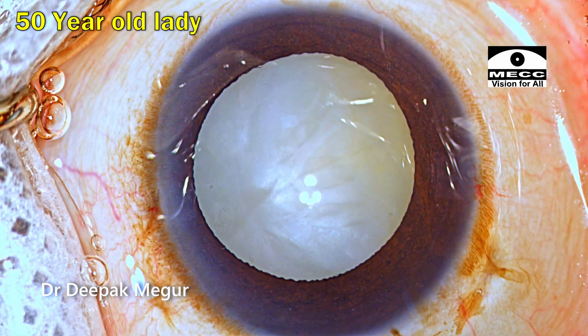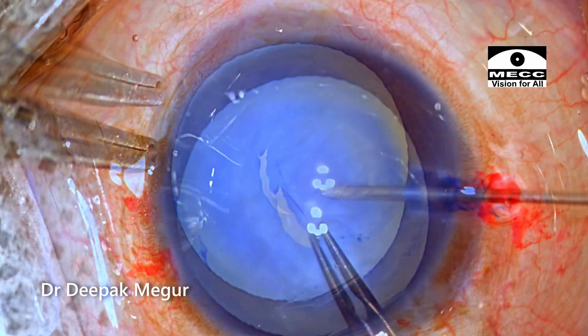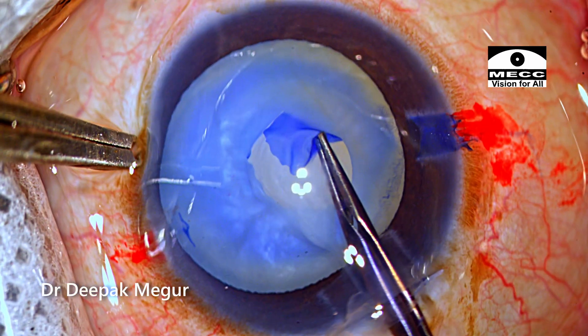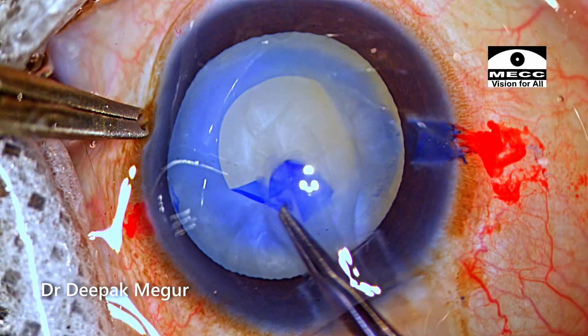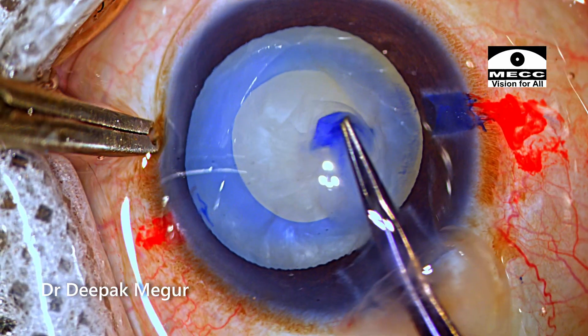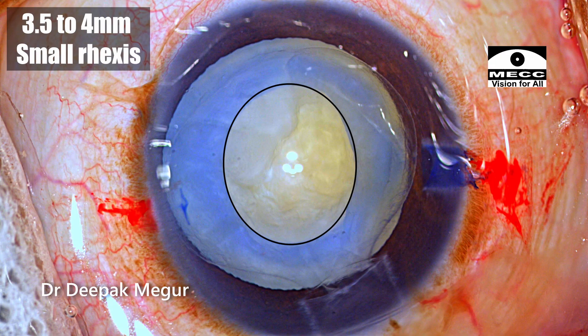This is an eye of a middle-aged patient who has an intumescent cataract. The plan is to do a two-stage rhexis. I am very careful to control the size of the rhexis, and I end up with a rhexis which is about 3.5 to 4 mm.